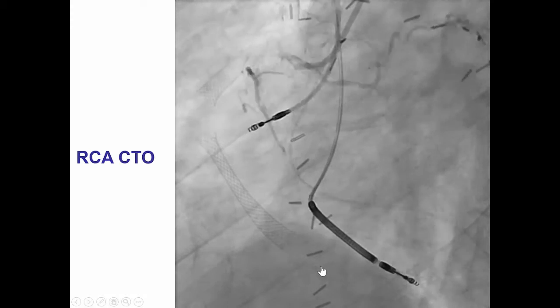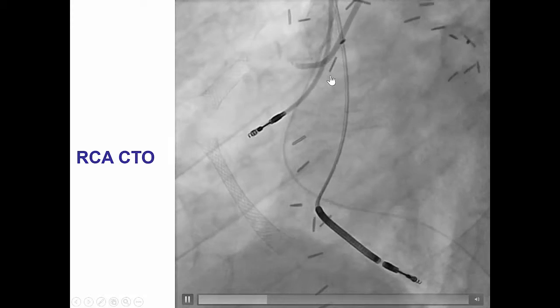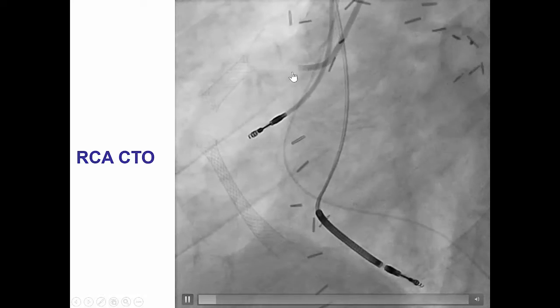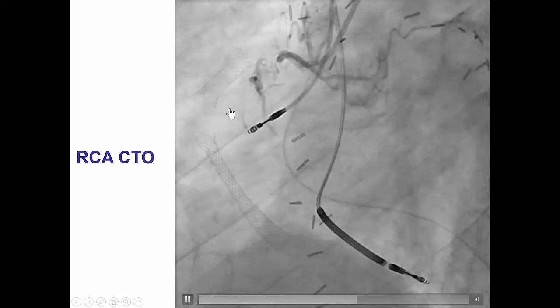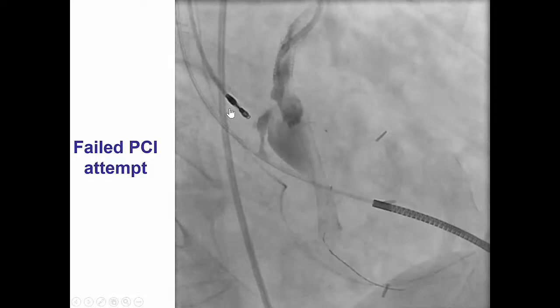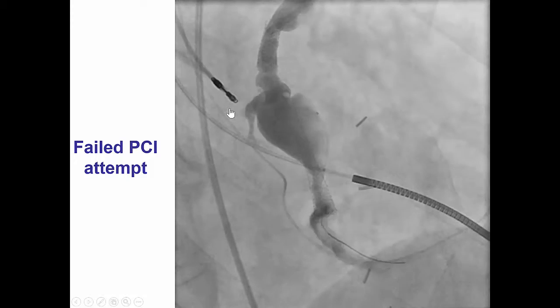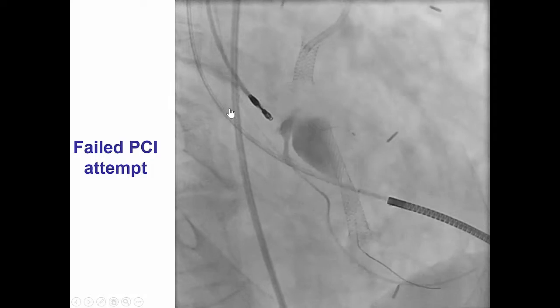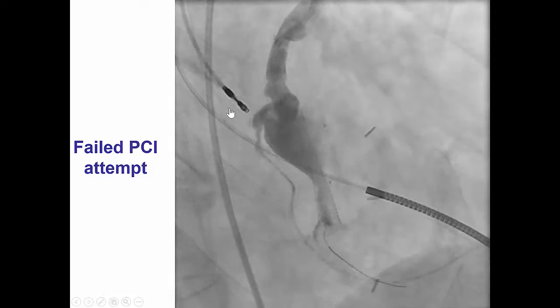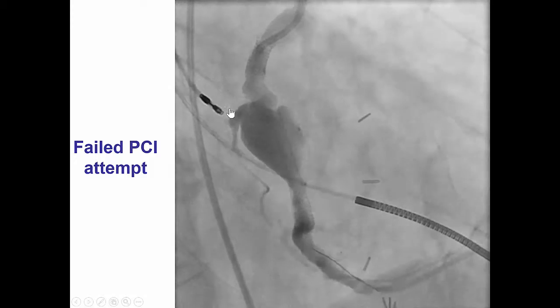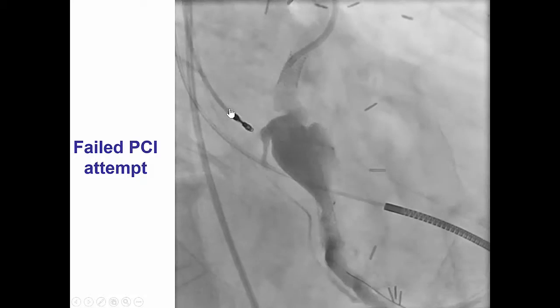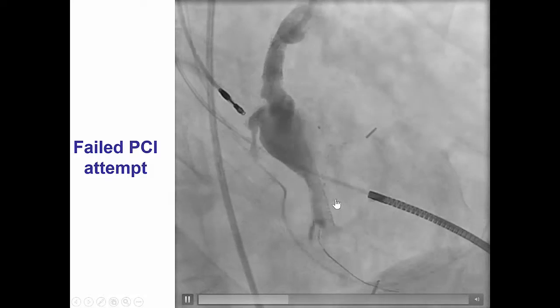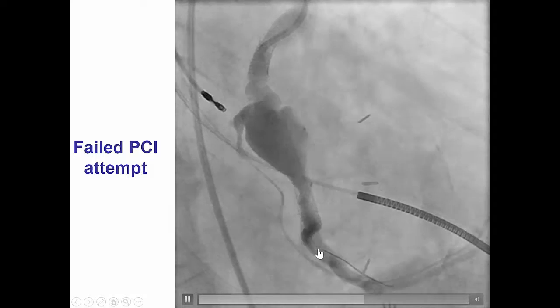The native right coronary artery was occluded. There was significant proximal cap ambiguity with multiple bridging collaterals. At a previous institution there was an attempt to recanalize the CTO of the right coronary artery, including an attempt to cross the vein graft toward the PDA; however, it was not possible to advance a microcatheter through the stent struts distally.